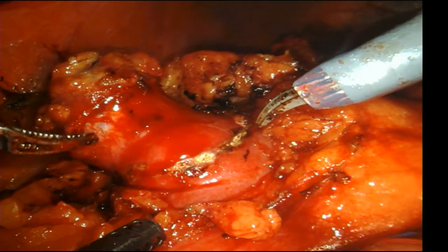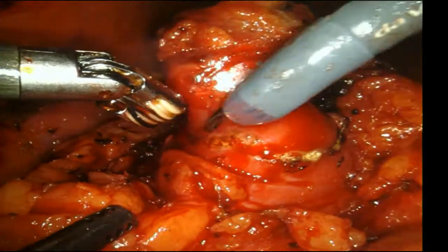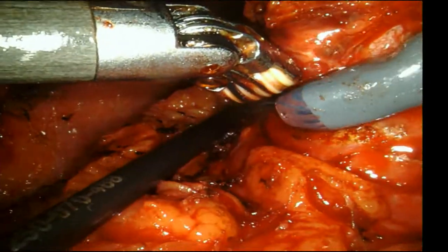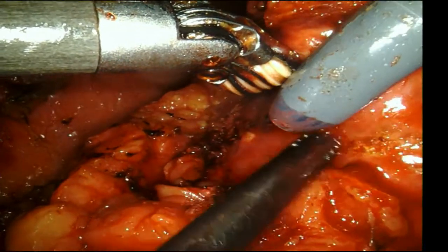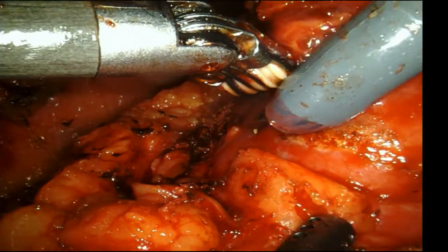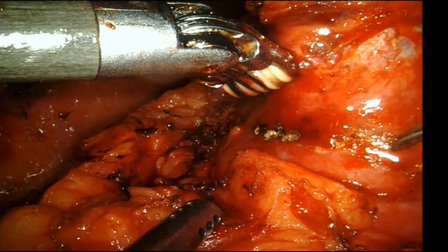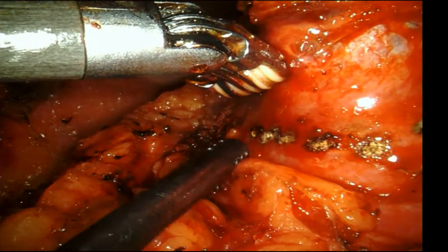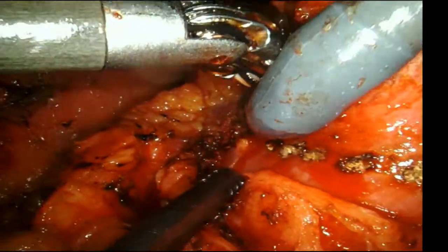All right, so the dose of green that we're giving here is a fifth of a cc. And you're probably saying to yourself, what is that? Why would you give a fifth of a cc? That's crazy. Well, because there's a difference between when you're doing it for perfusion and when you're doing it for margin assessment. If you give one or two cc's like you would for perfusion, everything turns green, including the tumor. And it's going to be useless.